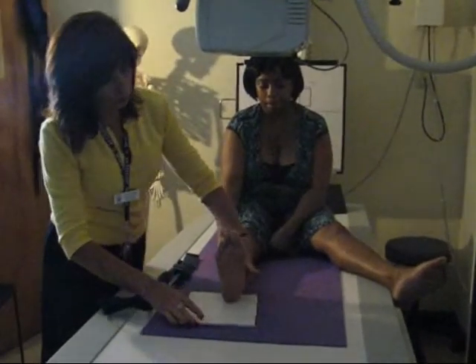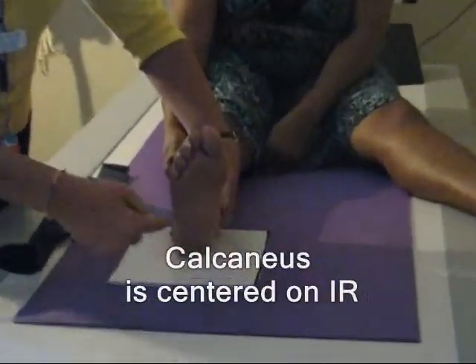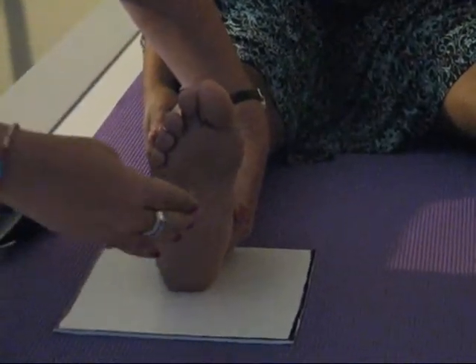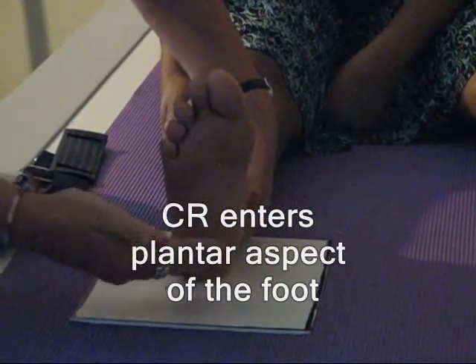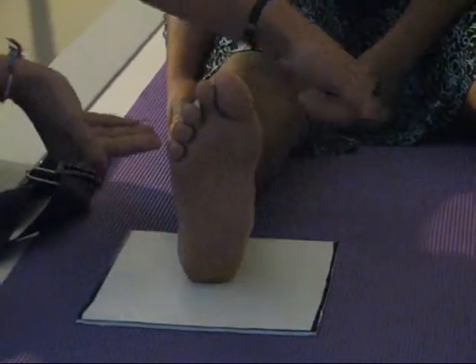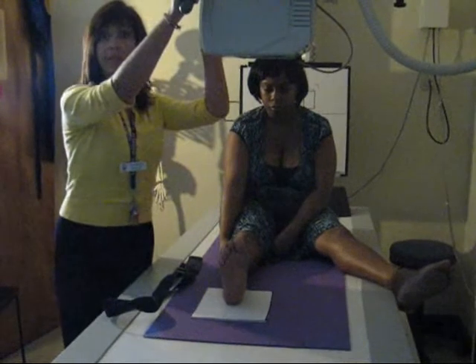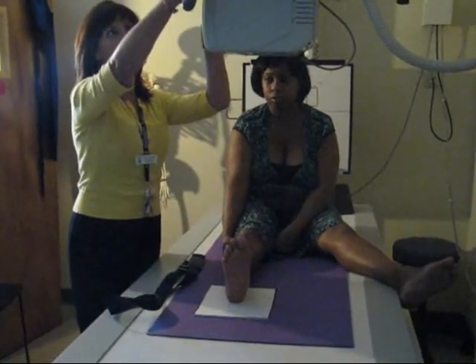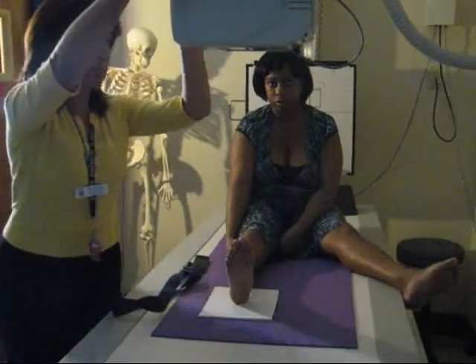For the axial, we want to see the heel bone through plantar-dorsal, so the central ray enters the plantar aspect of the heel and comes out the dorsal part. For that, of course, we need some angulation and some participation from the patient if possible. It will help make the projection a little more detailed.